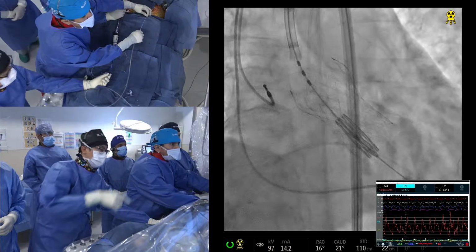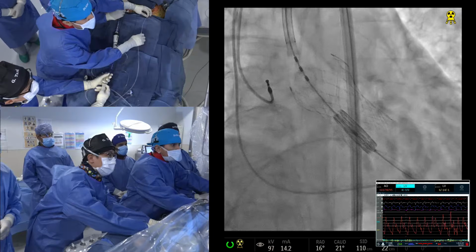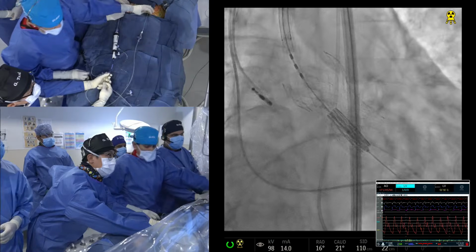So you can see the big cell of the Evolut. You can count. We're going to aim for node 4. We don't want to aim too high, although the 26 will fall short, so we'll keep that in mind as well. That's okay. Picture.